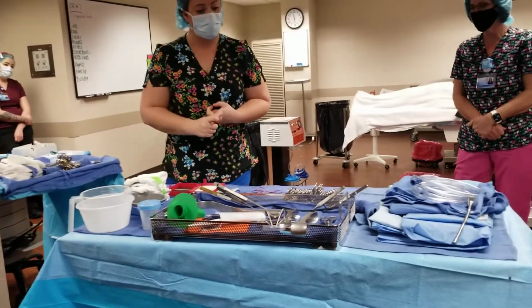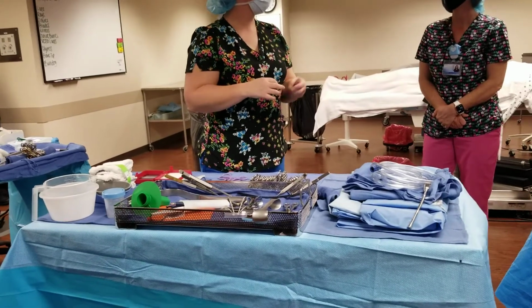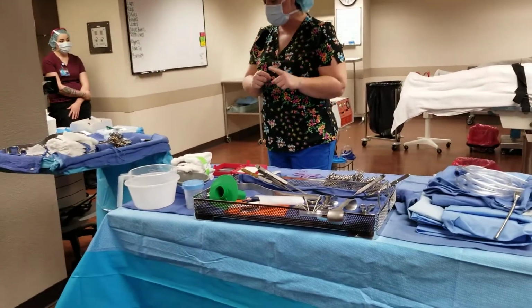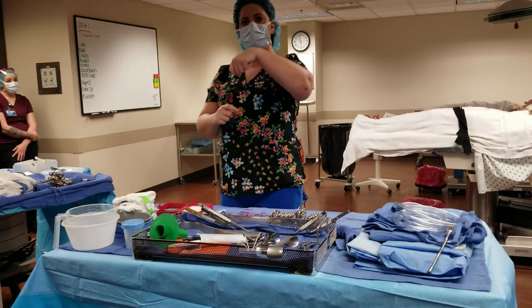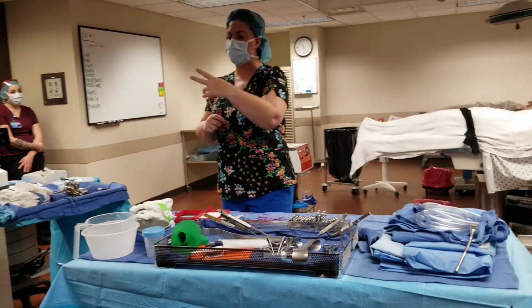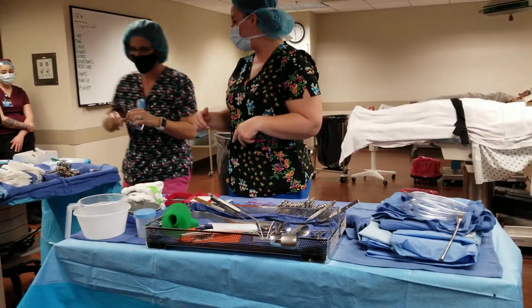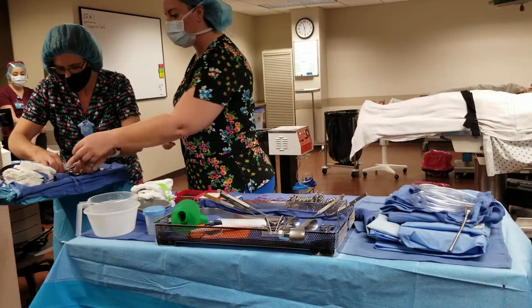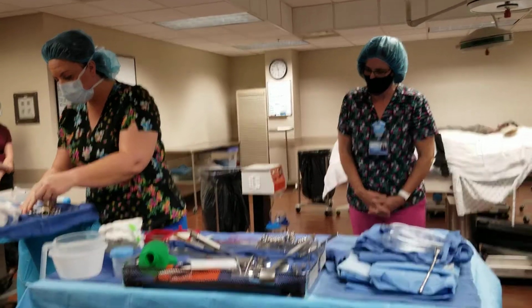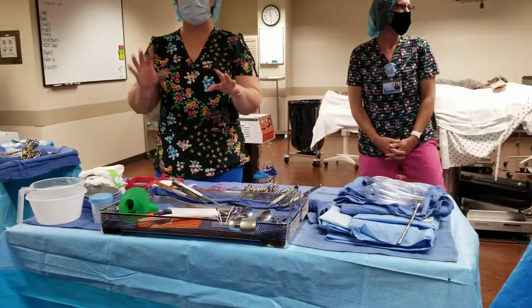One thing we don't have is the Lister bandage scissors? We've got one, I think. To get into the uterus, they make a nick in the uterus with a 10 blade, and then you give them the bandage scissors, because they put that on the inside of the uterus next to baby and cut. Do you guys remember the Lister bandage scissors? They'll use that knife and then the Lister bandage scissors to open the uterus.